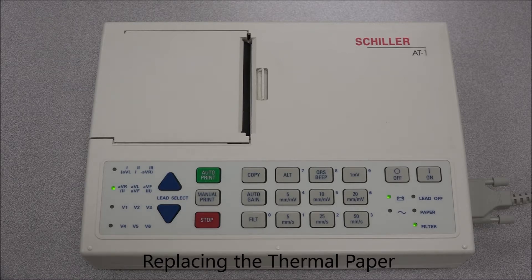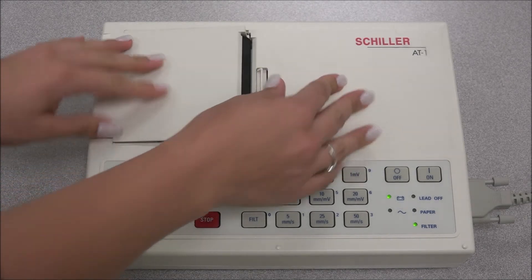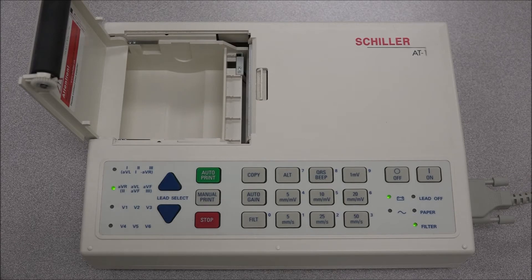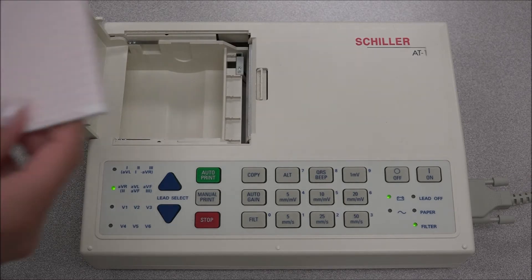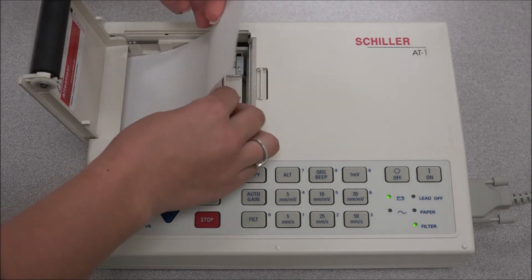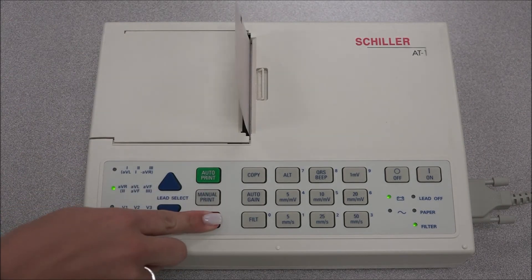Replacing the recording paper in the internal printer: the recording paper must be replaced as soon as the end of the paper is indicated by a red stripe on the lower edge. Press the latch for the upper tray to release the lid with the rubber roller. Remove any remaining paper from the tray and place a new paper pack into the paper tray with the printed grid facing upwards. Close the lid and press firmly. Press the stop key to transport the paper to the starting position.